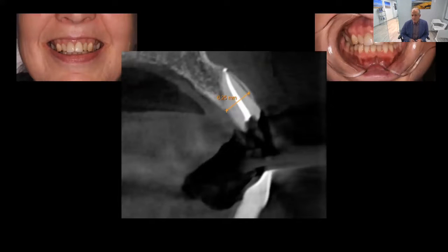And when I look at the cone beam in this case, if I didn't have 3D imaging, I look at the angulation of the tooth and then look at the angulation of where the bone is. Right? It's very, very different. So I think this is where cone beam imaging is just so important. Look at that. That's where the bone is. So if we didn't have this technology, that's probably where the implant would be placed, and that would be coming really far facially.